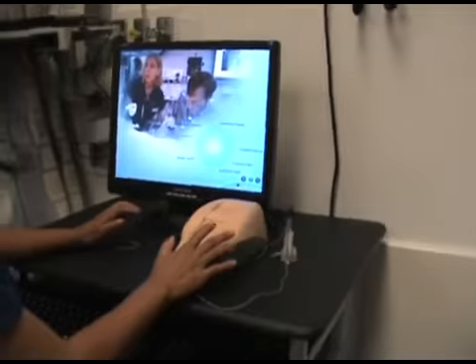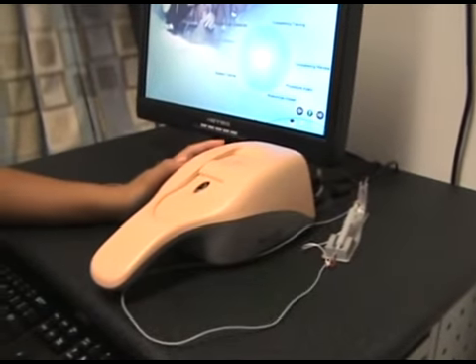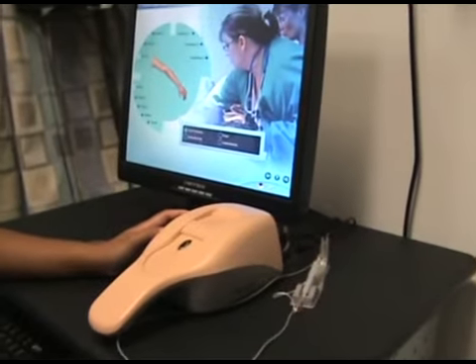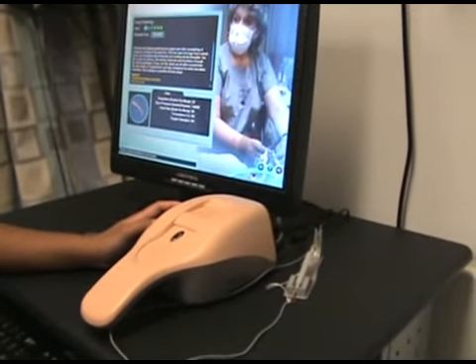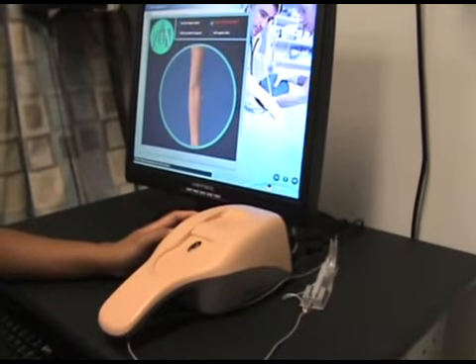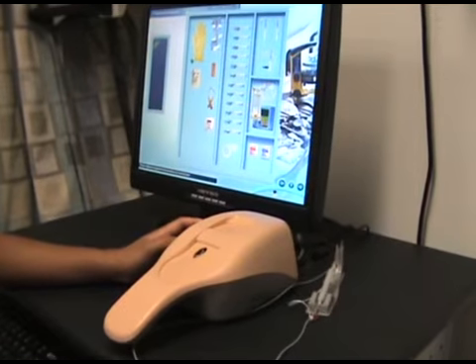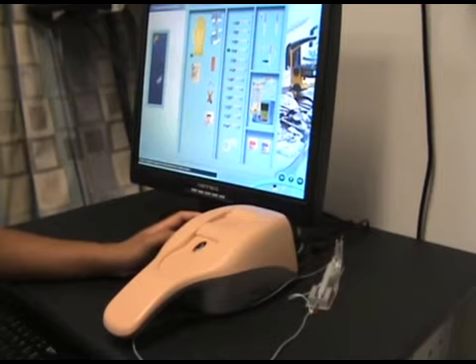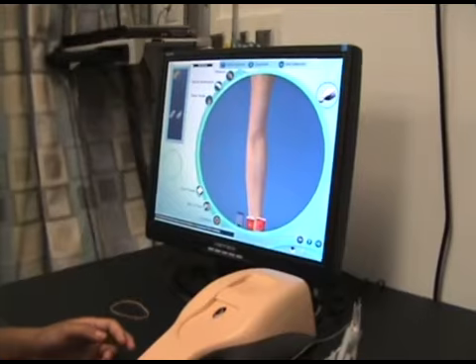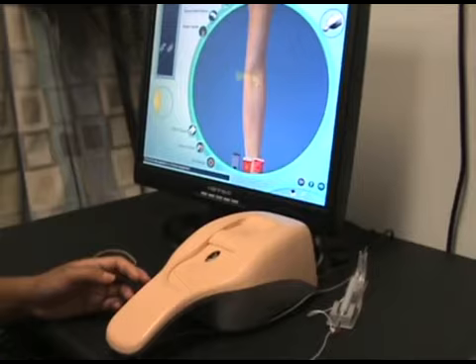Oh, and before I go, this is the actual arm that you use when you go to the practice case scenarios. When you choose your arm, student 1, let me just go over this. You choose your arm, let's just say left AC. So you see that AC? And then, after you choose your items, I'll just do the basics. Basically, you could palpate an IV.